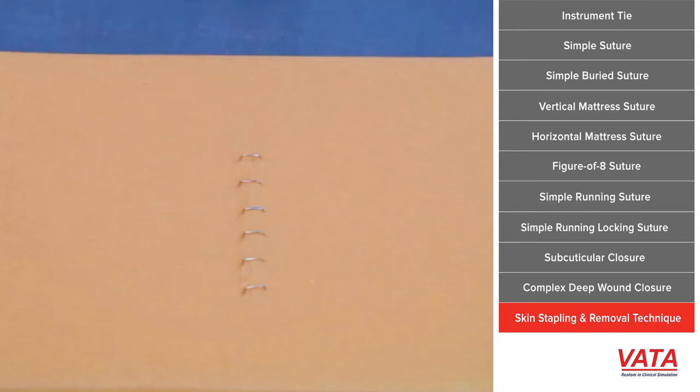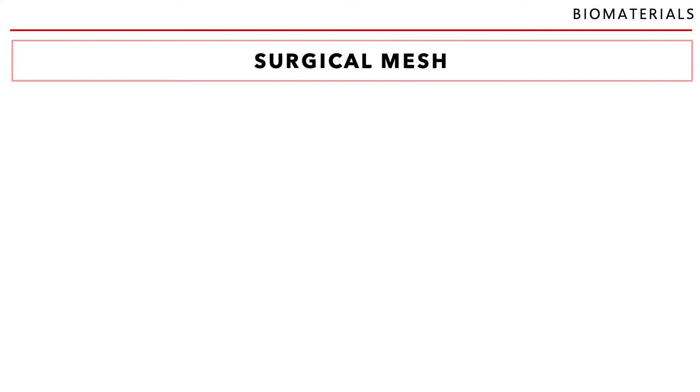But if you need to sedate, then you might need to consider why you're putting staples in the first place. If you're putting staples in the first place, you are already expecting that you will be doing this process of removal after 2 weeks. So why would you put staples in an aggressive dog? When you need to remove them in a very, very delicate way. So you might need to consider using absorbable suture material instead for those aggressive animals so they don't need to come back for suture removal. The surgical mesh, okay?